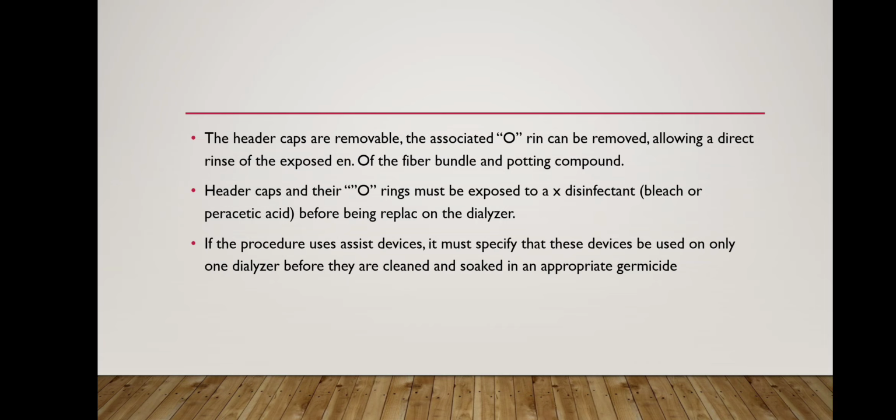Header caps and their O-rings must be exposed to disinfectant, meaning bleach or peracetic acid, before being replaced on the dialyzer. If the procedure uses such a device, it must specify that these devices be used on only one dialyzer before they are cleaned and soaked in appropriate germicide.